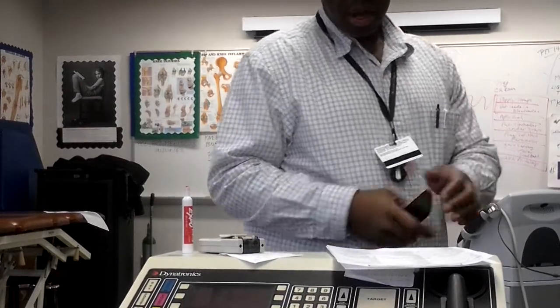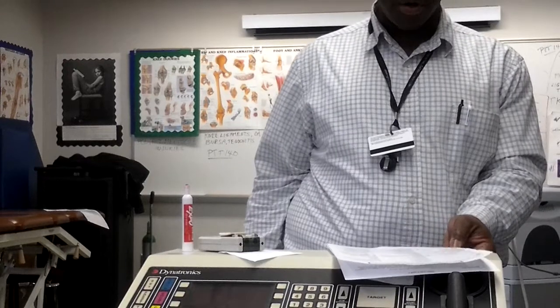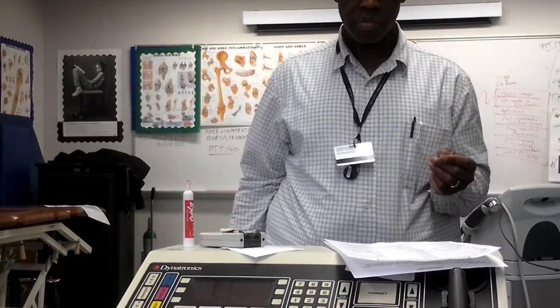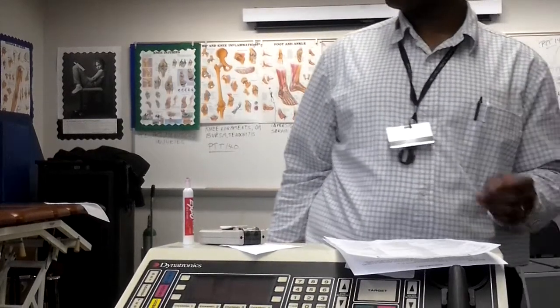Okay. Note alternate names. Here are some alternate names for the pulse rate. We have pulse rate, frequency. What are the other names that we named earlier? Cycles per second, pulses per second, hertz, pulse rate. Good. And then you have pulse width and pulse duration, both the same.